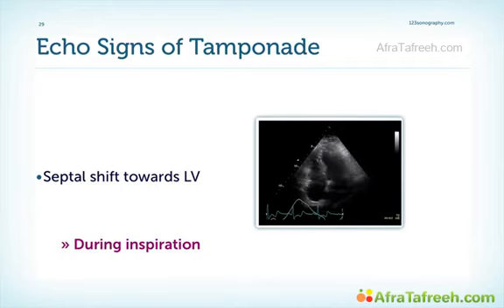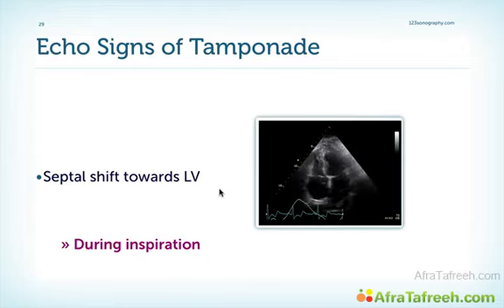And here we also have the respiratory curve, which shows us exactly at what time the interventricular septum moves towards the left. If you look closely, you can see a snapping motion towards the left ventricle just at the moment when the patient inhales. This is a very strong indicative sign of tamponade. To demonstrate the interventricular dependence, you also use Doppler.